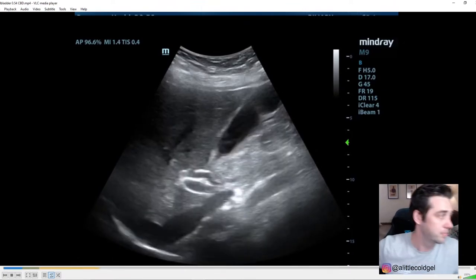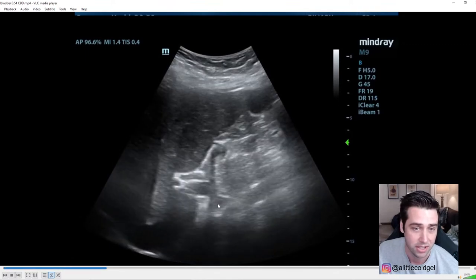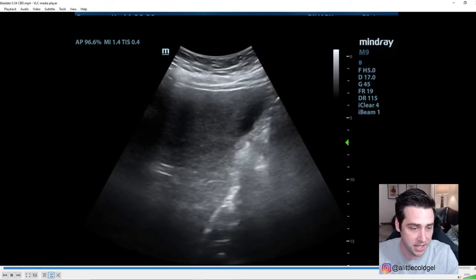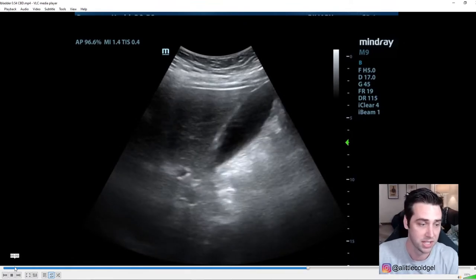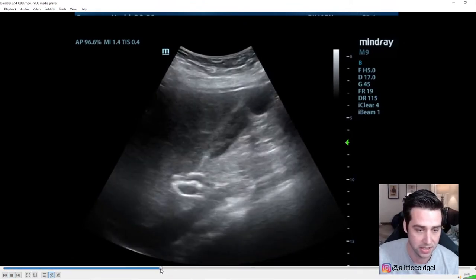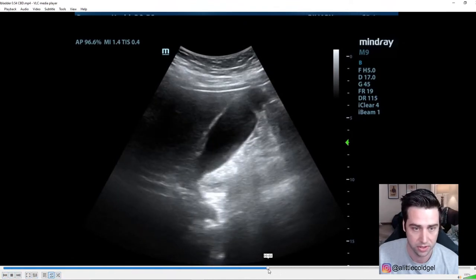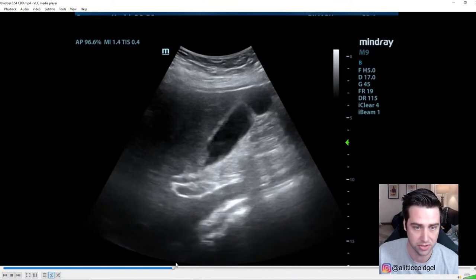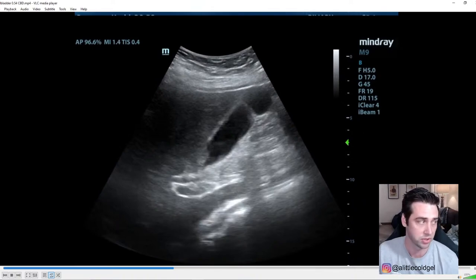That's the gallbladder — you don't see really much in it; this could be a little bit of sludge down here. One thing to notice is that you can actually see the common bile duct in this image. Right here you can see one structure right above another — this is probably the portal vein, and this should be the common bile duct up here. When you're looking for common bile duct obstruction, that's actually where you're going to measure the common bile duct.